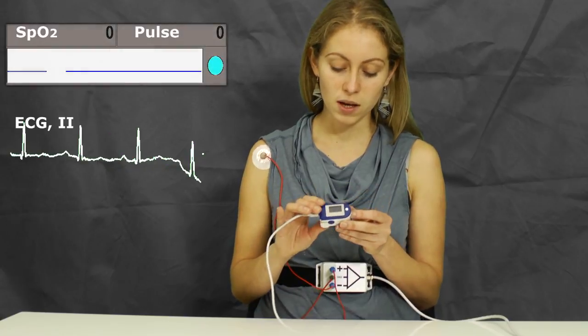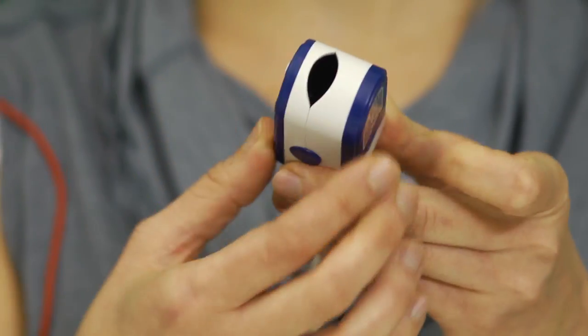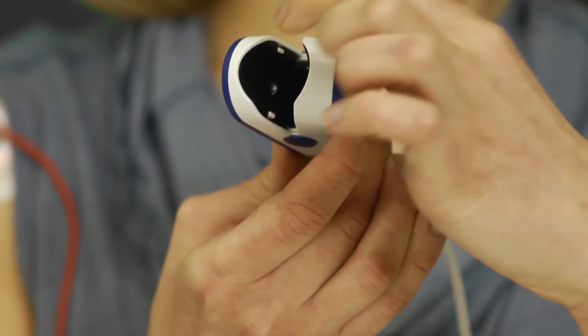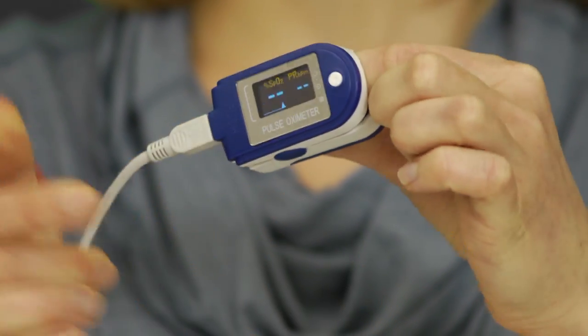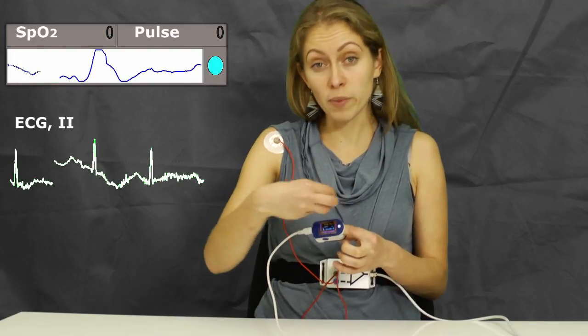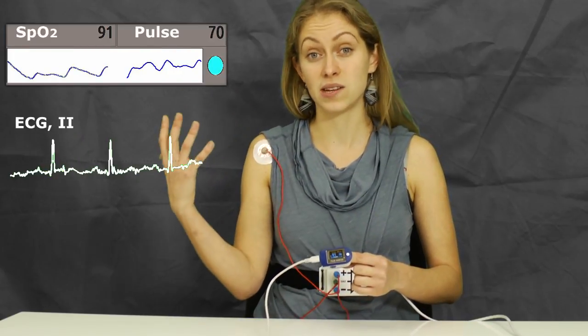This is how it works. First of all, switch it on — there we go. We take a look at this flashing light inside, and after having inserted my finger in it, it shines through my finger. Every time that my heart beats, it releases a flow of blood which absorbs some of this light, and that is then translated into the signal that we see on the screen.